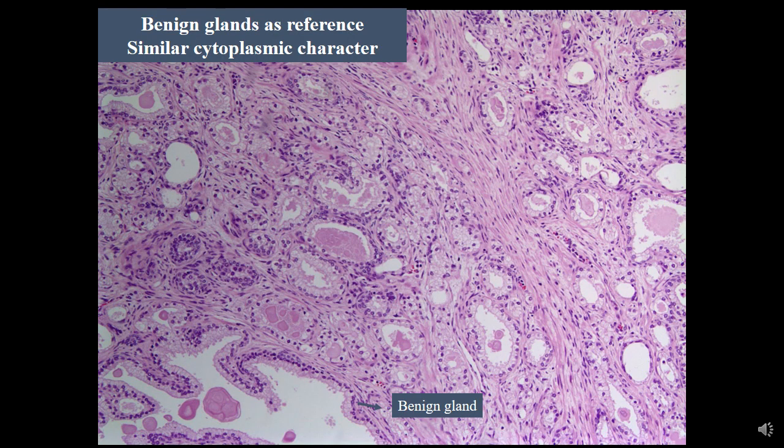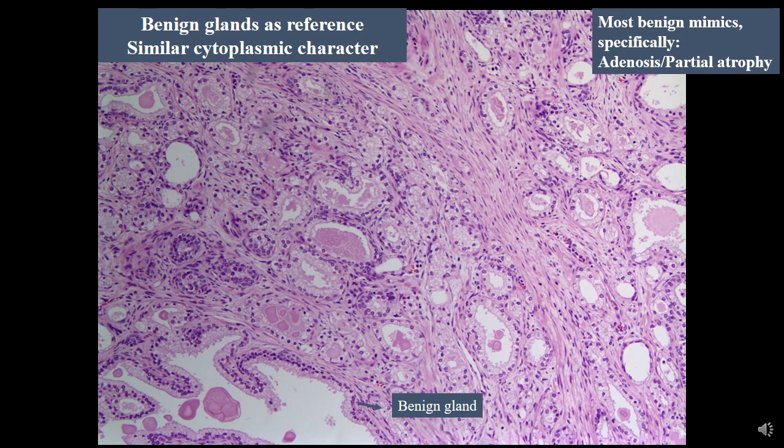The next important feature is to pay careful attention to adjacent benign glands as a reference point. When you have a small glandular proliferation — glands in question that can give an atypical presentation — and these small atypical glands have essentially similar cytological and cytoplasmic characteristics to adjacent benign glands, it usually suggests a benign lesion. Here is a nice example of adenosis, also referred to as atypical adenomatous hyperplasia, where the small glands have similar cytoplasmic and cytological characteristics to the adjacent benign glands, pointing towards a benign diagnosis.